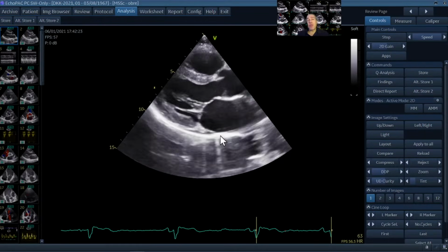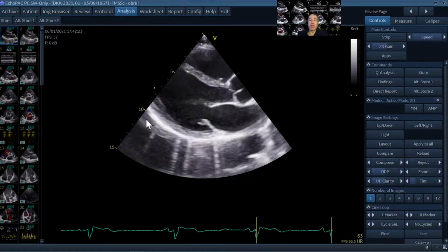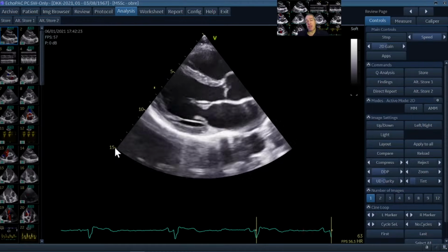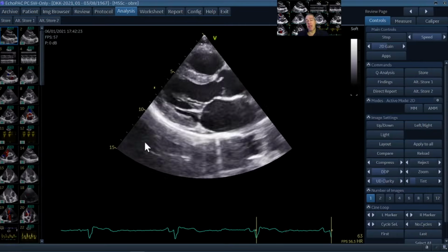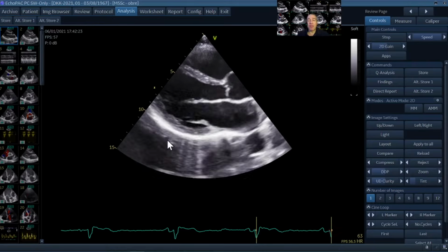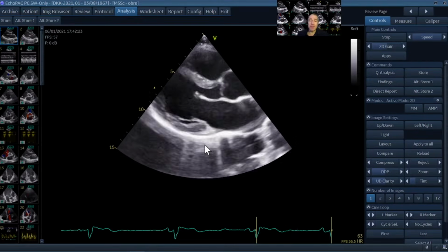And if you do parasternal recordings, always make sure that there are also some 1 or 2 centimeters behind the left ventricle within the image. Now this with 15 centimeters depth, I could have reduced that maybe a little bit to 13 or even 12 centimeters. But there should be a little bit more space visible so that you see and can identify pathologies here.